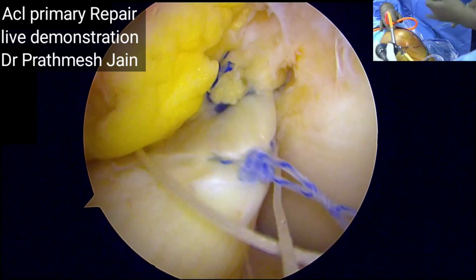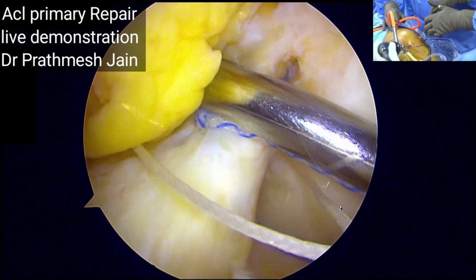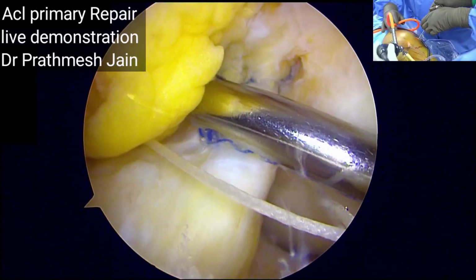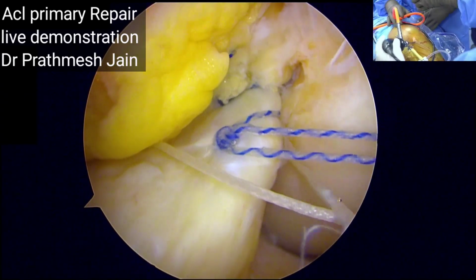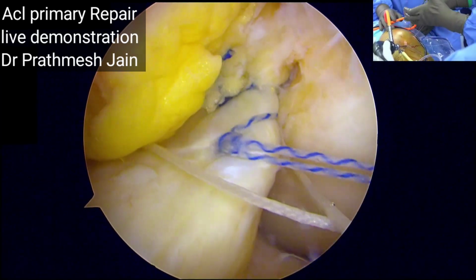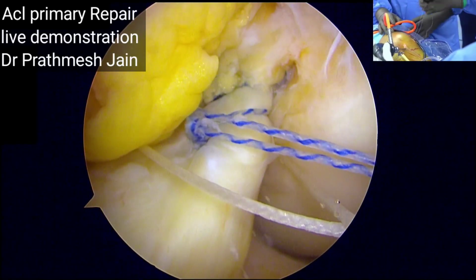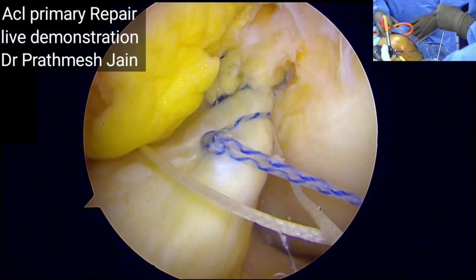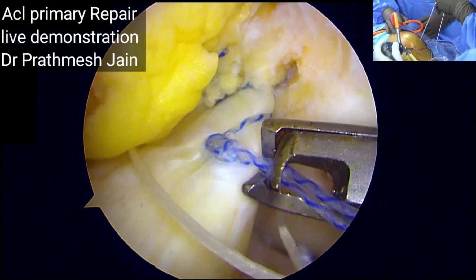There is minimal foreign body, so whenever the healing takes place, it will be more or less like a normal ACL, a normal sort of feeling for the patient, because whatever we have done has led to the repair of the torn ACL, and there is no foreign material involved in the repair or reinforcement of this tissue.